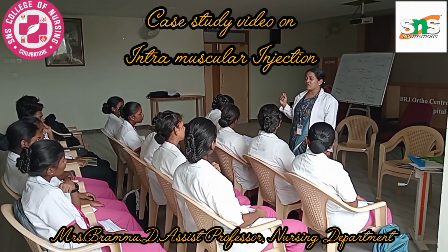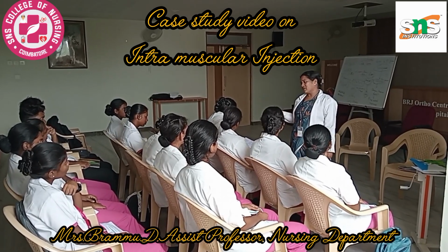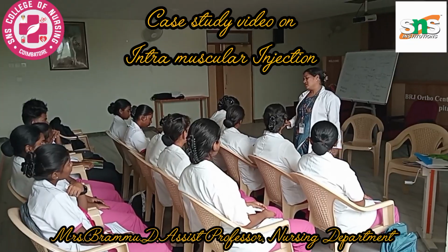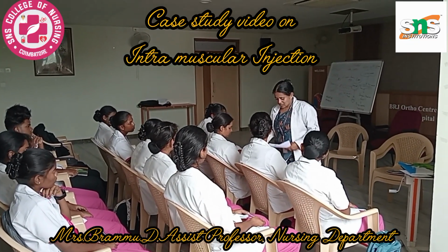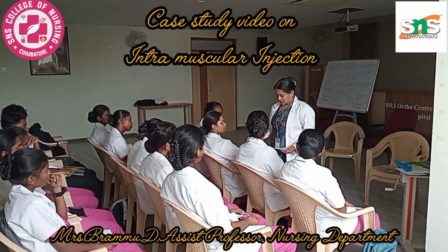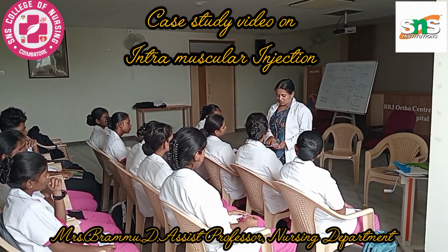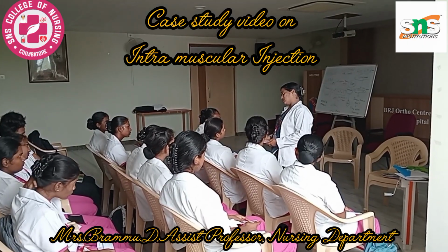So the first point is to review the medication order, whether the doctor has given the exact drug. Compare it, whether it is there in your medication trolley. Then identify the patient: take the patient record, the medication record, and identify the patient. Okay, so I am with the right patient, OP number 9236. On the patient ID tag 9236, then that is the right patient.